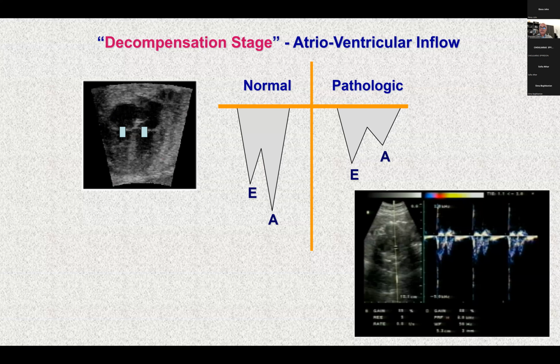altered ratio between E and A wave, because, as you can see, the A ratio is the active ratio, active phase related to the atrial contraction. And the reason is, again, in the reduced performance of the atrial myocardium that produces this hemodynamic event.